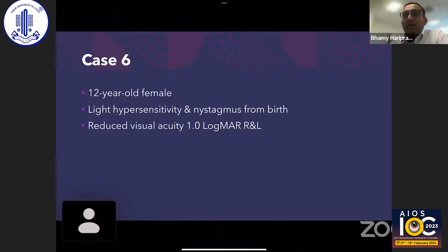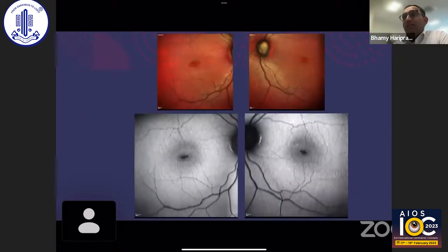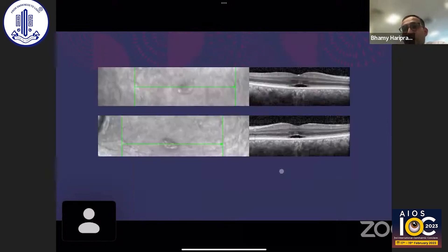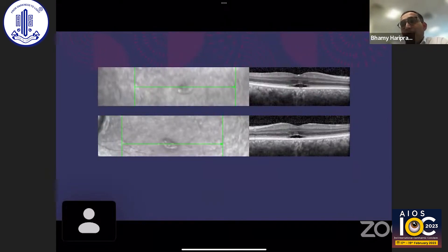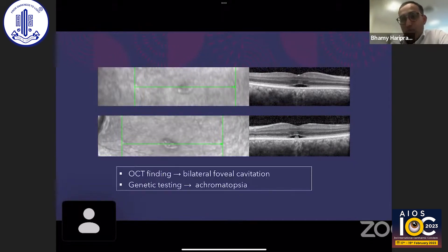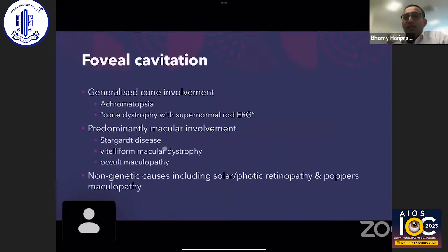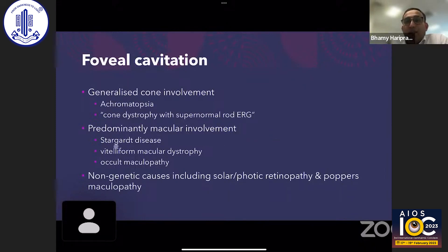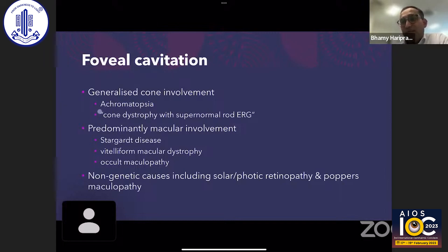Case 6 is a 12-year-old female with light sensitivity and nystagmus from birth, with visual acuity reduced to 1.0 logMAR (6/60 vision). Multicolor imaging with fundus autofluorescence shows characteristic lesions, and OCT reveals classical foveal cavitation, most characteristic of achromatopsia. Genetic testing confirmed this. Foveal cavitation can also be seen in cone dystrophy with supernormal rod ERG, vitelliform macular dystrophy, Stargardt's, and solar retinopathy, but is most associated with achromatopsia, especially with light sensitivity indicating cone dysfunction.